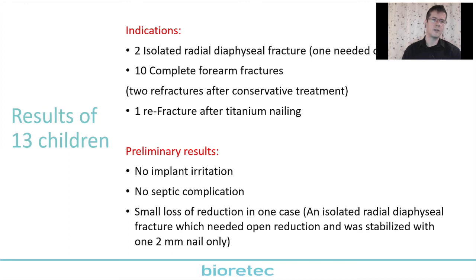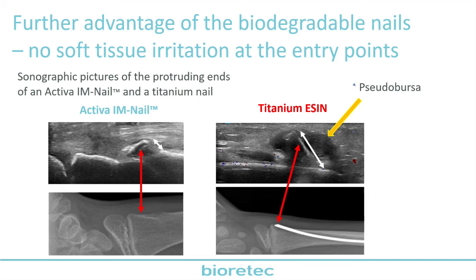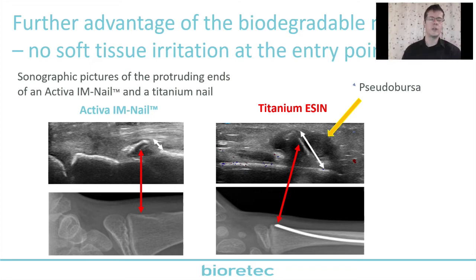And here, this is a very interesting picture. I think we have made some ultrasound examinations as well. This is a further advantage of the biodegradable nail, that it won't cause, or we hope it won't cause, soft tissue irritation. If we see this picture, we can see a traditional elastic nailing, and we can see the ultrasound picture. On the X-ray, it seems that the nail is at the level of the bone, but in real time, it is not.